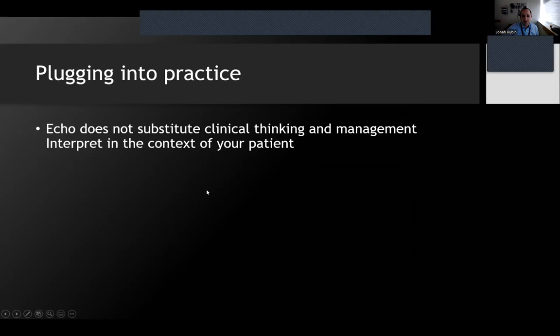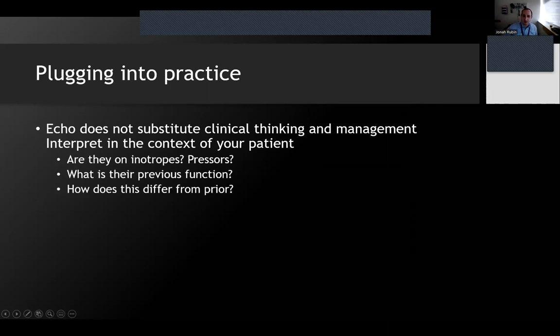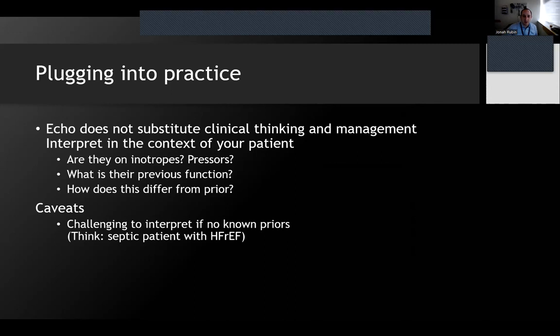So final thoughts here, echo does not substitute your clinical thinking and management. Of course, it has to be interpreted in the context of your patient. Are they on inotropes or pressors? What was their previous function? How does this differ, as I mentioned? And remember that it's difficult to interpret if you don't know their priors.